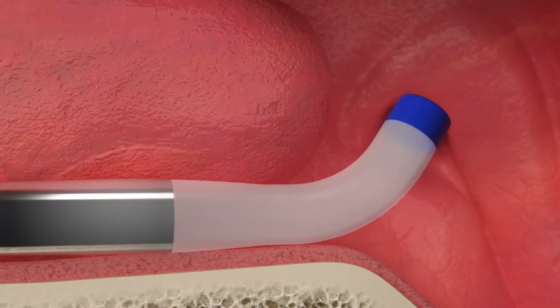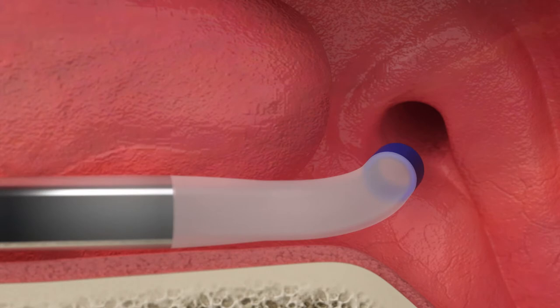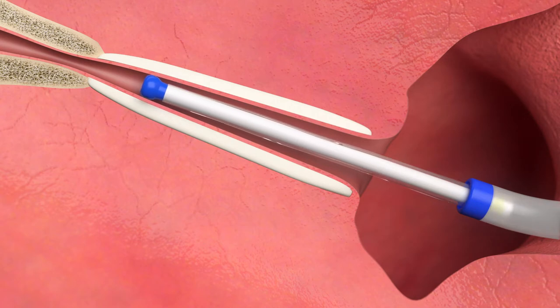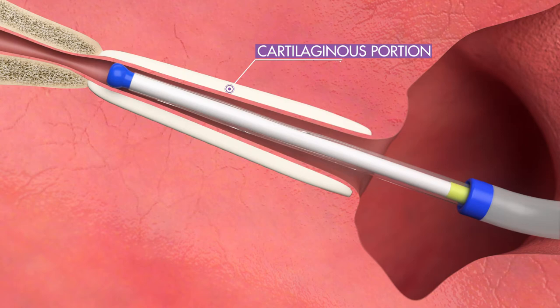Rotate the guide catheter so that the tip angle is aligned with the trajectory of the eustachian tube. Advance Aclaret Era into the eustachian tube. Advance the balloon until the yellow proximal marker exits the guide catheter or until resistance is felt. The resistance indicates that the bulb tip has reached the narrow isthmus to align the balloon with the cartilaginous portion of the eustachian tube.